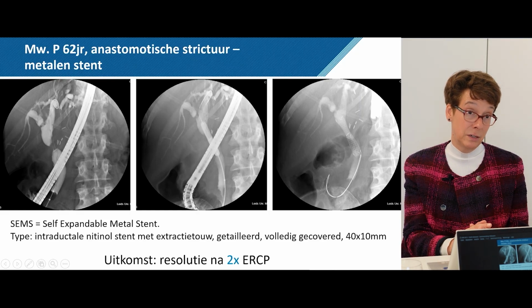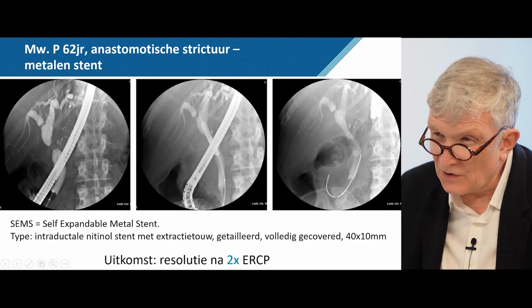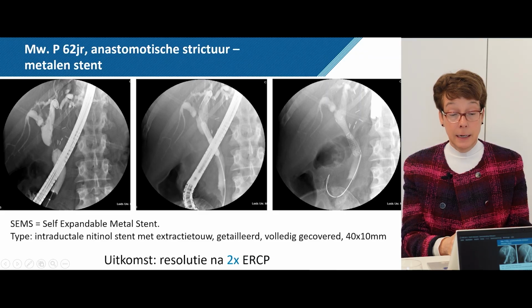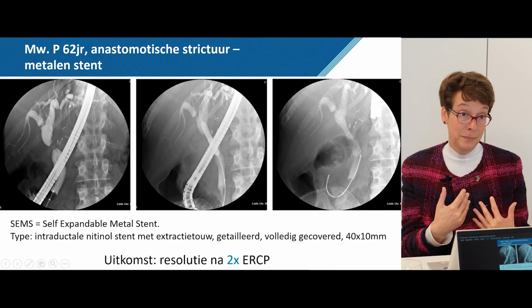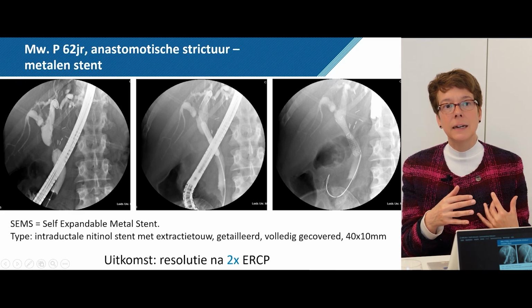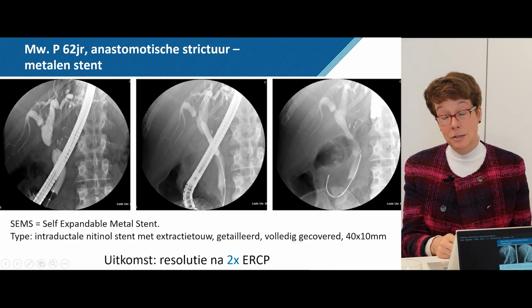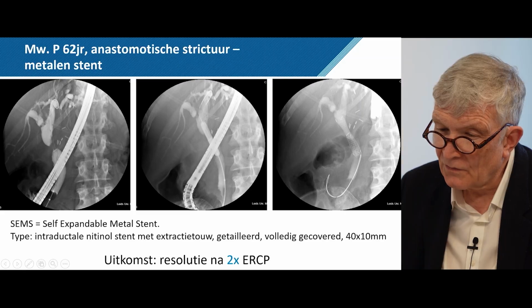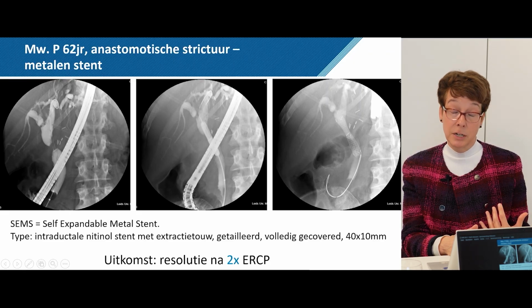The advantage of the metal ones is that you can send the patient away for half a year. Okay. But the classic indication for that is an anastomotic stricture, and the more complex and proximal it gets, the less you would place metal stents. Yeah, in my opinion the metal ones are only for the anastomotic strictures. And most of the time, these anastomotic strictures you can manage. Within a year, you have them under control. The more cumbersome strictures are the strictures either at the hilum or even intrahepatic. And diffuse ones. Yeah, and even for the diffuse ones, we sometimes have to go for retransplant.